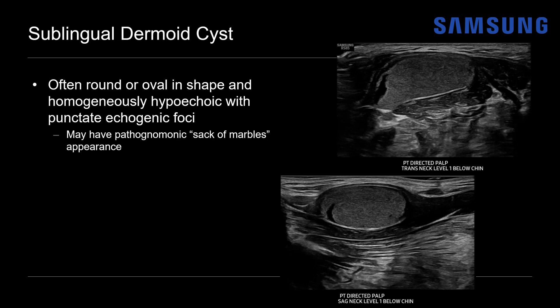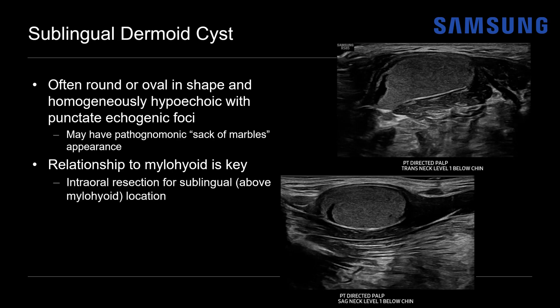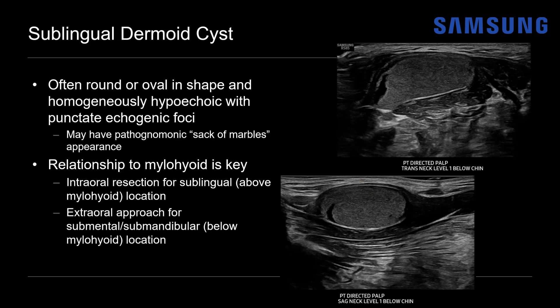When evaluating these masses on imaging, the relationship to the mylohyoid muscle is key for surgical planning. If the mass is above or superior to the mylohyoid — as in this case — it's sublingual in location and allows for intraoral resection. Since this is the patient's chin and this is the mylohyoid, the mass here is superior to the mylohyoid moving toward the oral cavity. However, if the mass is below the mylohyoid, that indicates it's in the submental or submandibular location, which would require an extraoral approach.